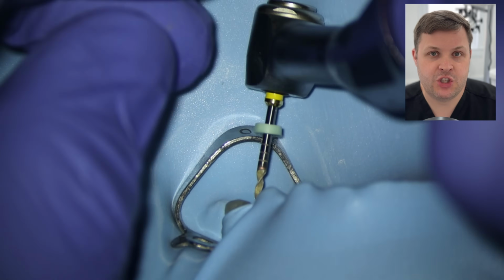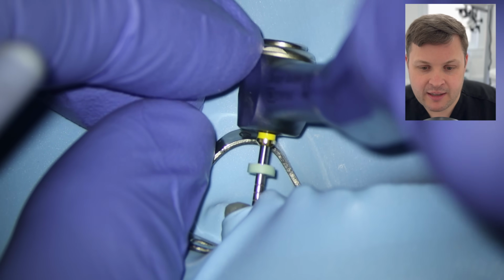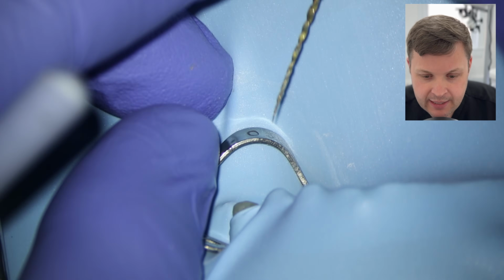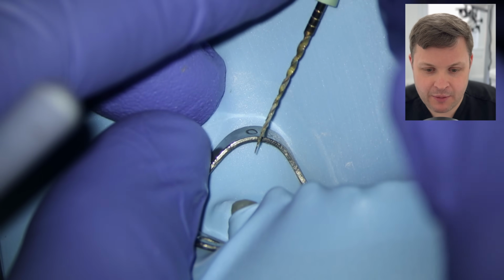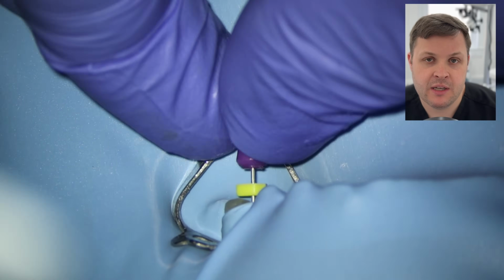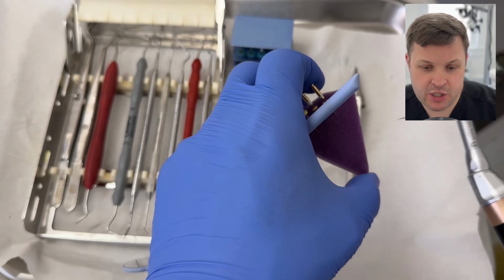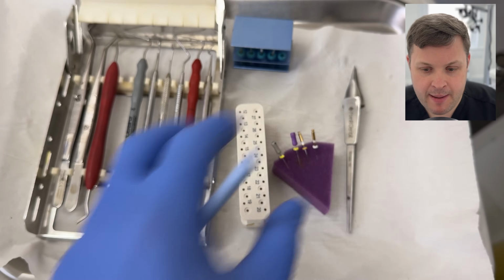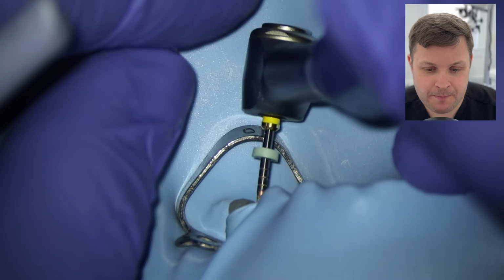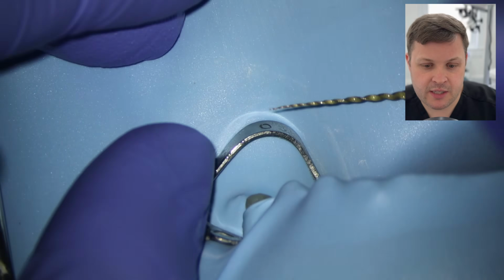And then what I'm going to do is I'm just going to put it in T mode until we get past, and then I'm getting a little bit of resistance here. So I'm going to pull out. And what I noticed is when I pull out there's a lot of debris on there, and I'm just checking the end because this file has taken a lot of brunt. We're going to recapitulate and re-irrigate. Remember to remove the debris off this file. We use a little sponge. And then again, we're going to just repeat these actions until we're shaping at the end.